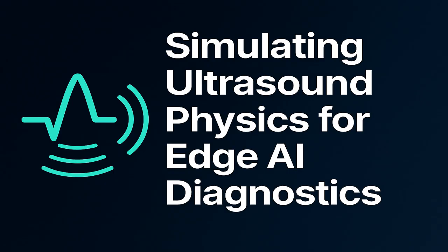So you're teaching it the nuance, not just the final answer. You are. This allows the small quantized student model to maintain the high diagnostic fidelity of the massive teacher model, but without incurring all the computational and memory overhead. It's how you get high-end diagnostic performance on a battery-powered tablet.